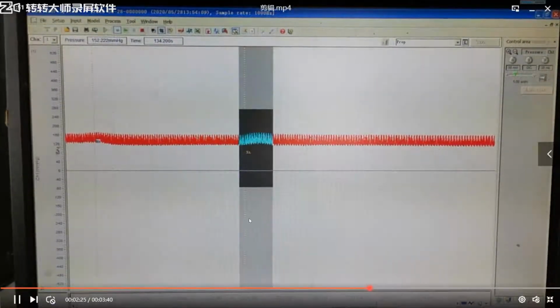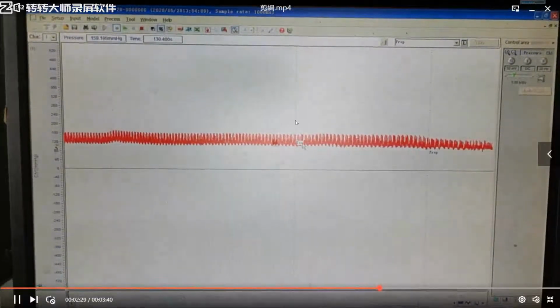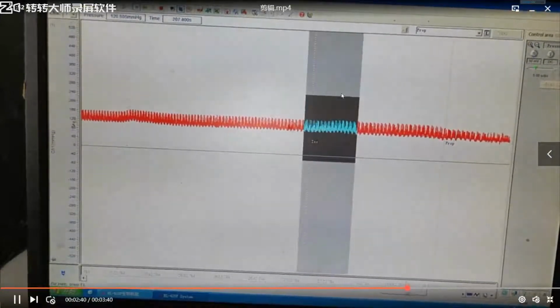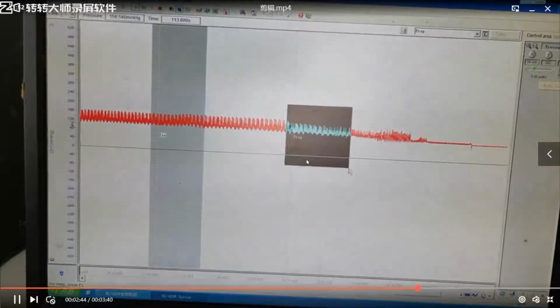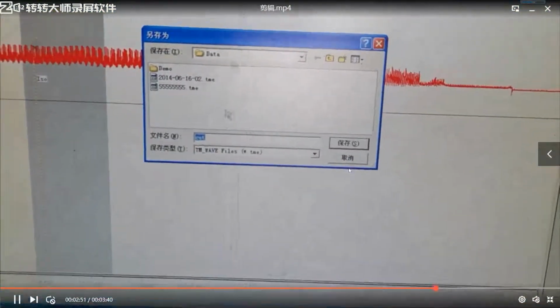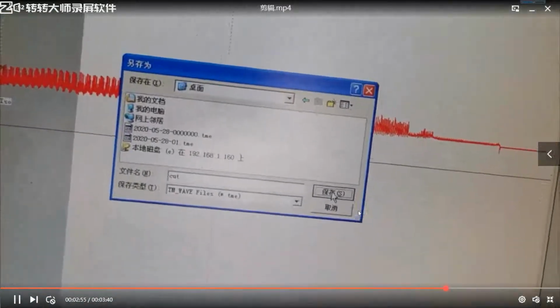And then we give isoprenaline. Where is isoprenaline? Here. No use. Cut this curve. And we give the beta receptor blocker. Just now phentolamine, and this is propranolol. Okay, and it reduces blood pressure.